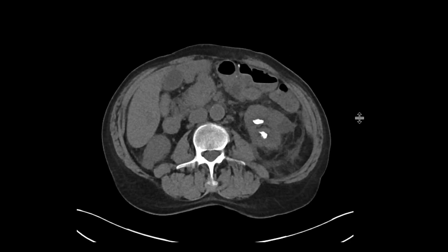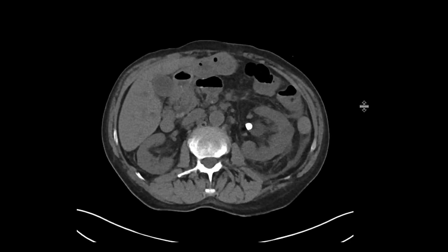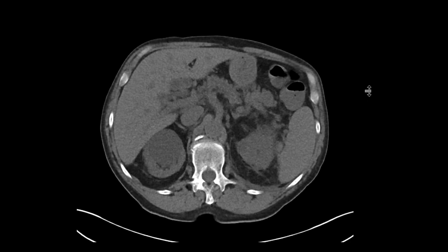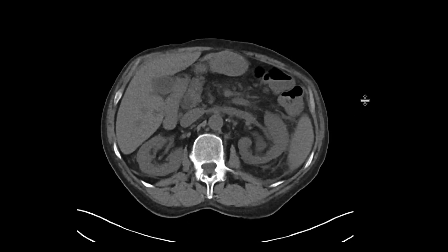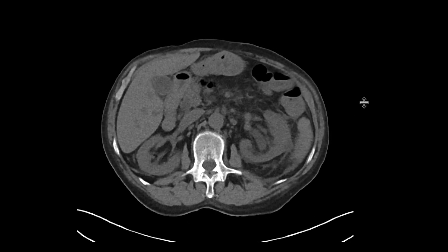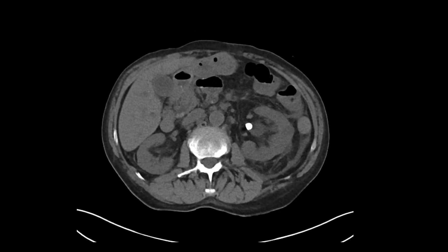Look at the kidneys — there are bilateral renal stones. There are some masses in there; some are going to be cysts, and some are difficult to characterize. On the left side, there's a little bit of hydronephrosis due to a stone right at that uretero-pelvic junction location.